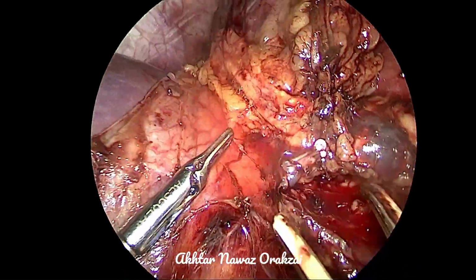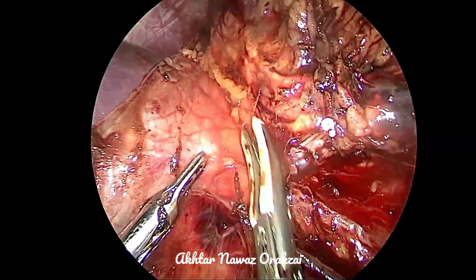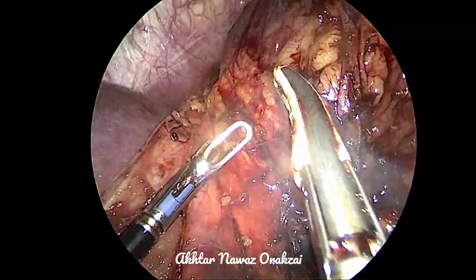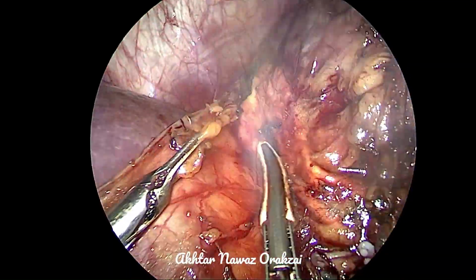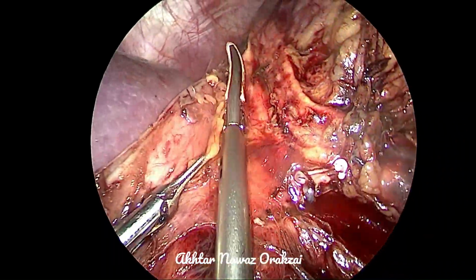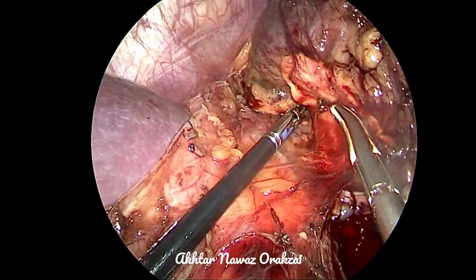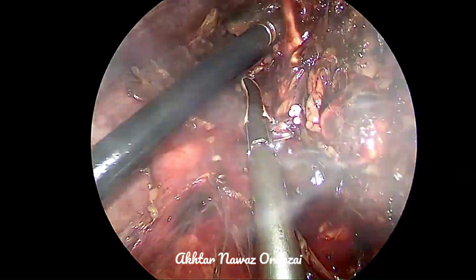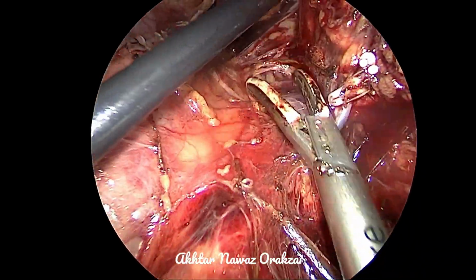Now we come to the medial dissection. Here we can see the normal adrenal gland along with the big adenoma. On this side, care must be taken medially because splenic vessels may be encountered during this dissection. So now you can see that the homework that we did has paid off here. The main procedure has been so quick and clean.